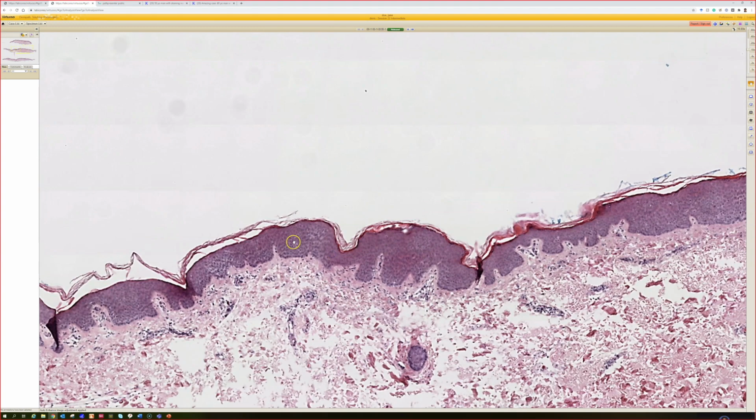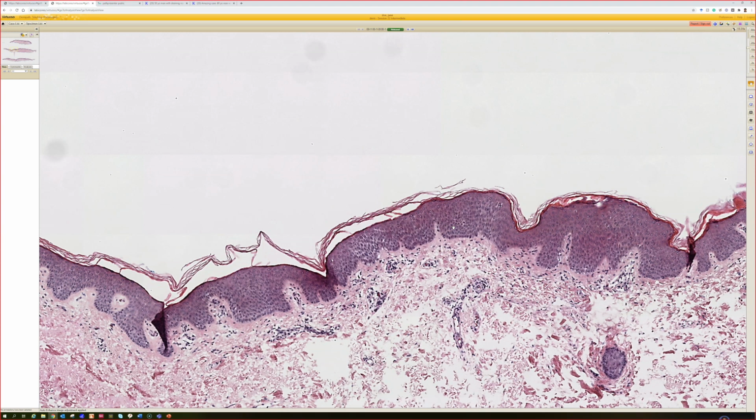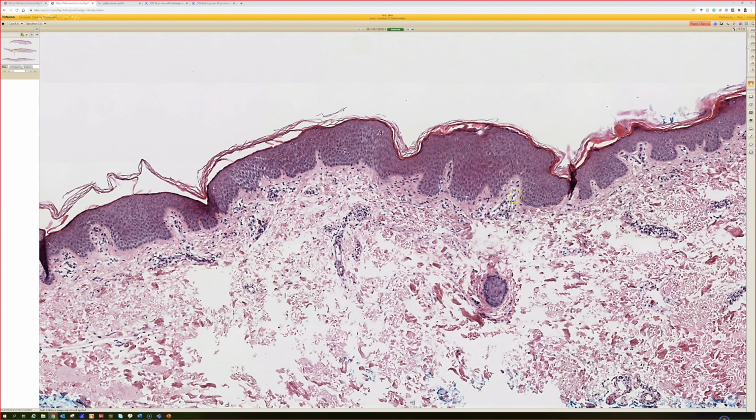So a couple other things I use are the clinical clues. If you as dermatologists tell me, rule out dermatophyte, or that you're thinking about dermatophyte. If you tell me that you put steroids on a rash and you thought it was spongiotic dermatitis or atopic or eczema, you put steroids on it and it got worse or didn't resolve, that usually will prompt me to do a PAS. If your differential includes something that has a ring or annular shape, like if I see spongiotic dermatitis, but you were asking for granuloma annulare, then I'm going to think about doing dermatophyte. Those are all reasons that will usually prompt me, in addition to the clues I see microscopically.